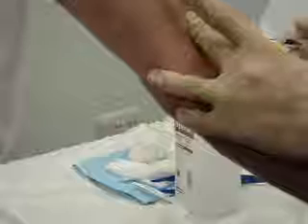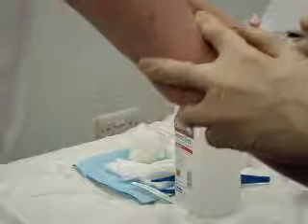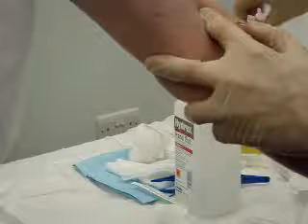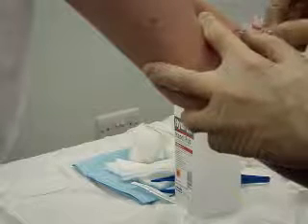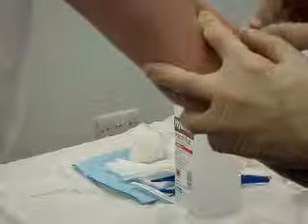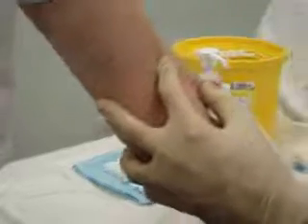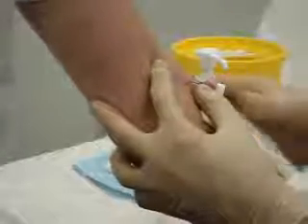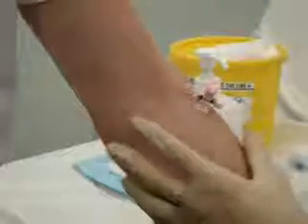So I'm going to do this quite quickly. I'm going to put a bit of pressure over the vein to stop the flashback, take the cannula needle out, and then put the cap back on nicely. Now, if you want to take blood from the venflon, instead of putting the cap on there, you can simply put a syringe on to take the blood. So as you can see, the cannula is in position quite nicely.